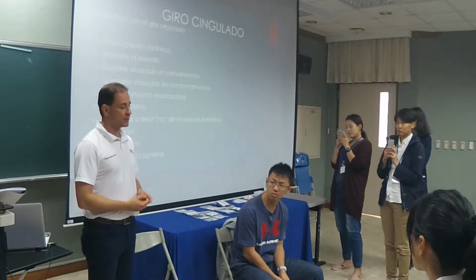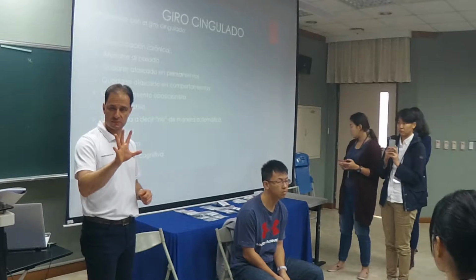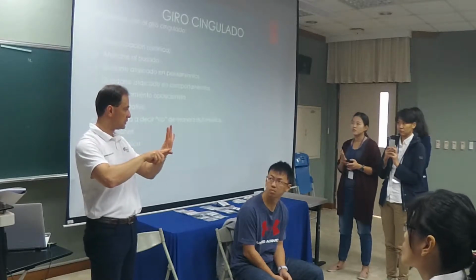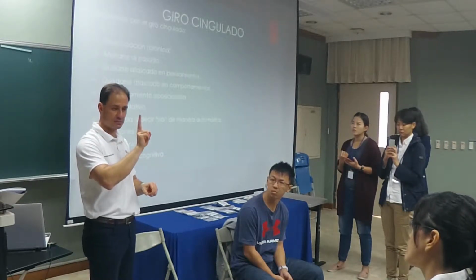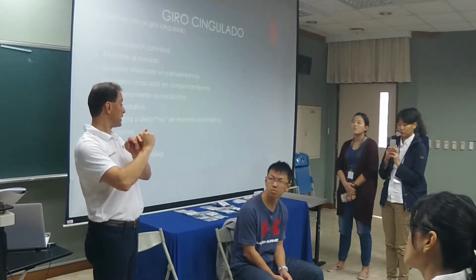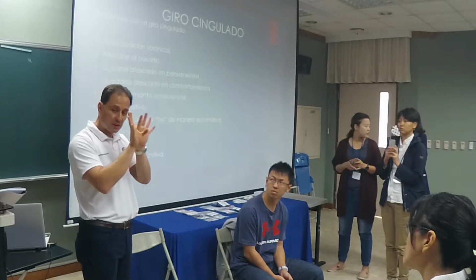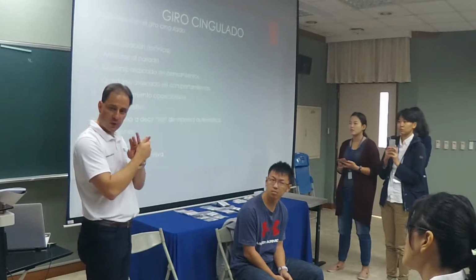Okay? So, if you want to write this down, go ahead and write it down. It's got 5 phases, 5 stages to the stress profile. Each of them lasts 2 minutes, for a total of 10 minutes. Okay, we start with a baseline. We record without him doing anything. He's just sitting there, and we record a baseline.